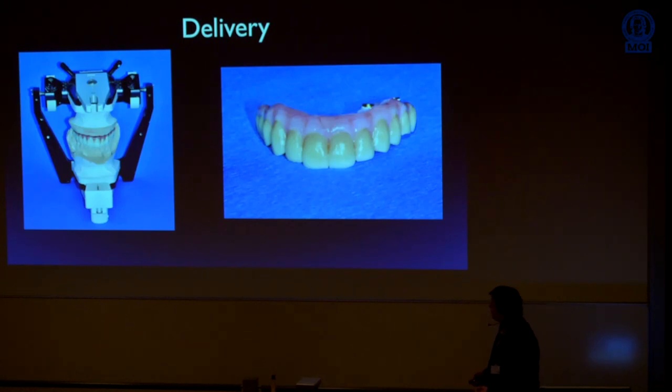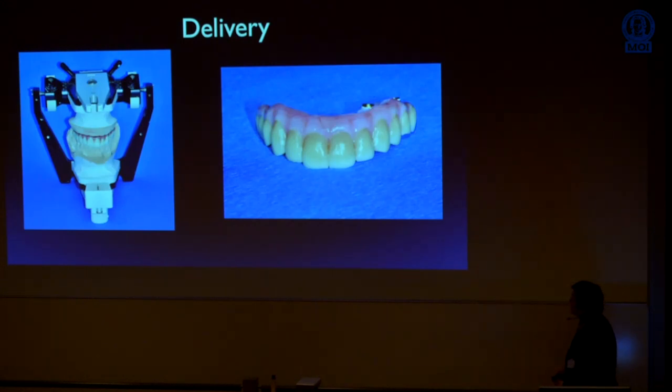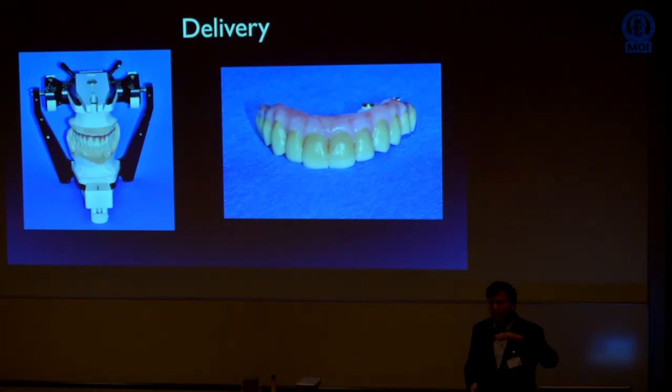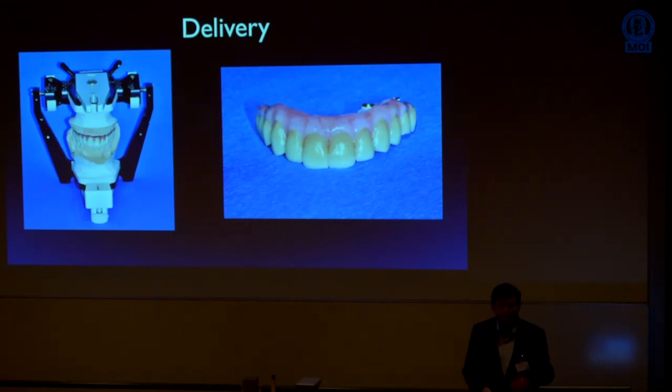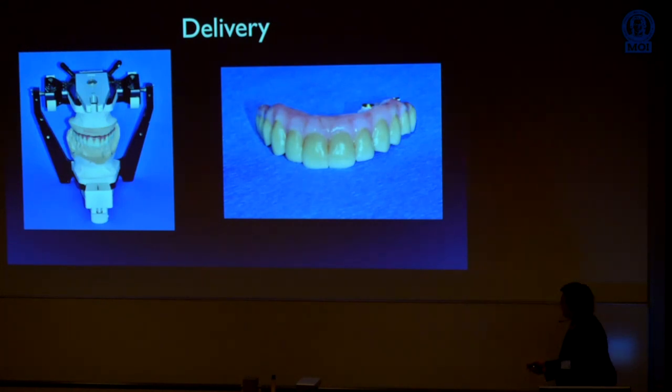There's a restoration on the articulator. There's a final model. And I'll go back to the photographs a little bit. Within that photographic survey that we do, you want to really pay attention to the smile line, where we want to make sure that we don't display that horizontal boundary. So those are things that we look at when we plan the case.